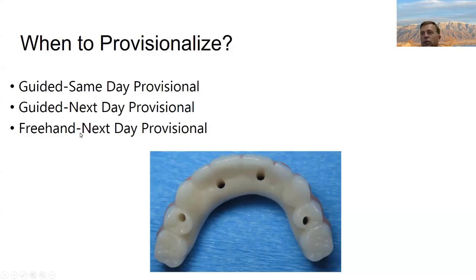So, with either freehand in a digital workflow or guided, in general, you're going to want to plan on provisionalizing the next day. Can you get a good result with both? Absolutely. It's more how you want to structure your practice and what works for your patients.